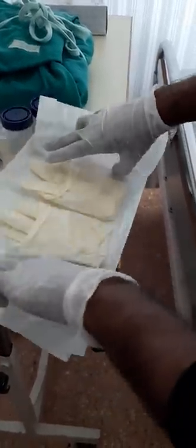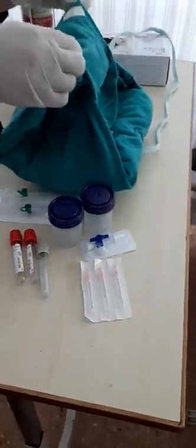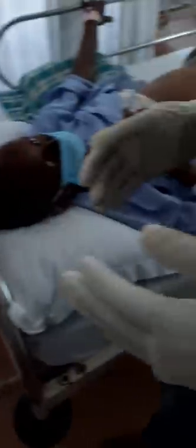I will guide you through the steps on how to do this. The first step, after cleaning and washing the hands, is that the doctor will wear sterile gloves, as you can see.